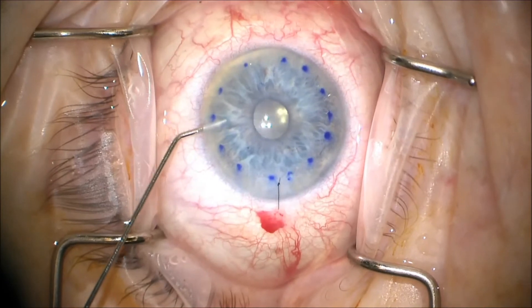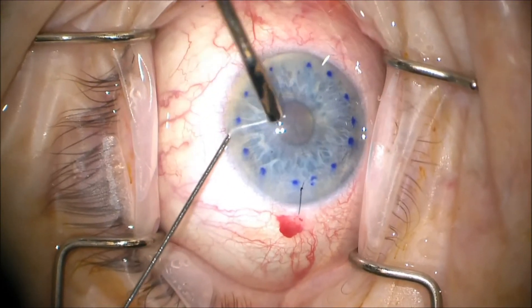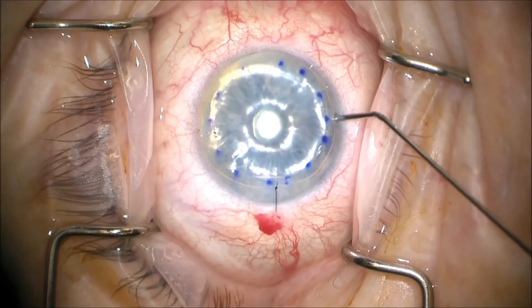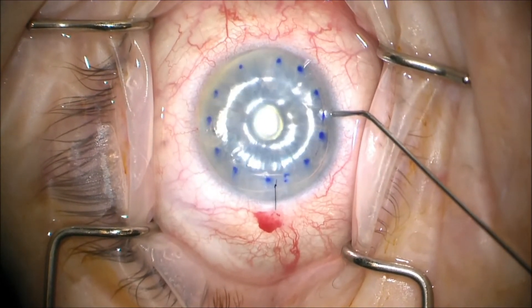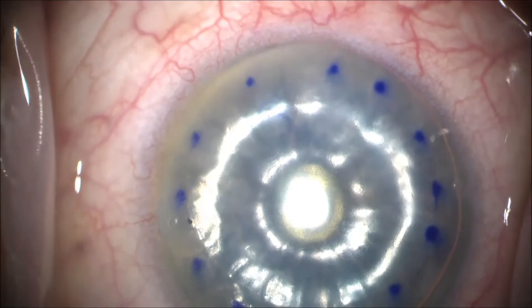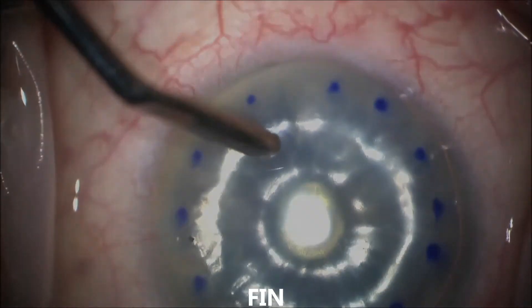Once it's centered properly, we use an air bubble to lock it into place — here doing 100% fill. And then while we're waiting, here's a zoomed-in view of the S, letting us know that we have the correct conformation, and we can now sleep well at night.